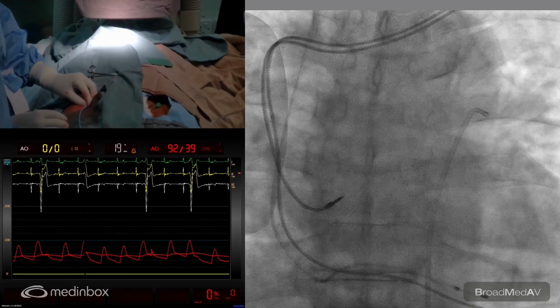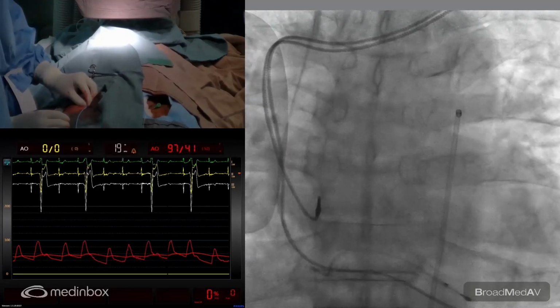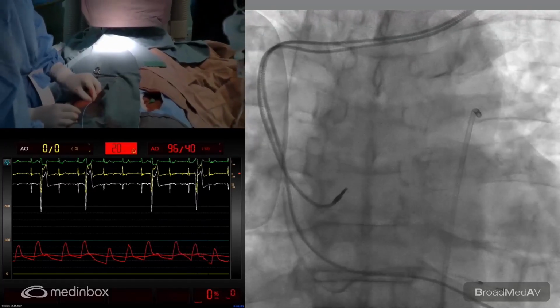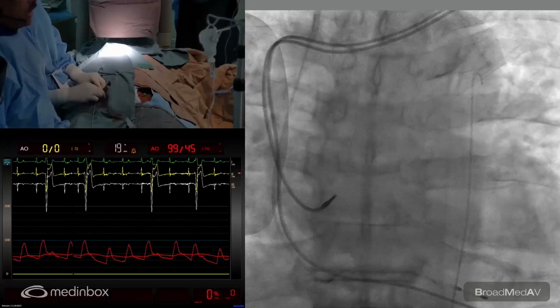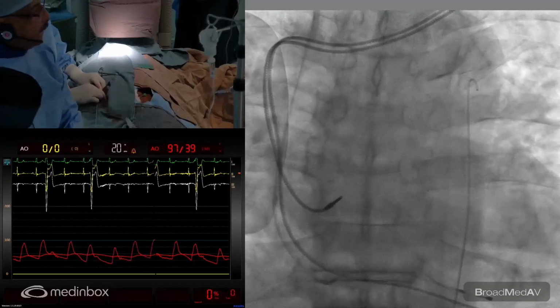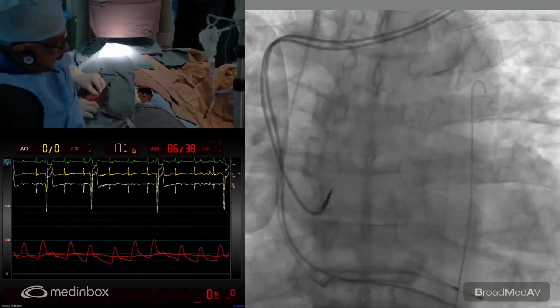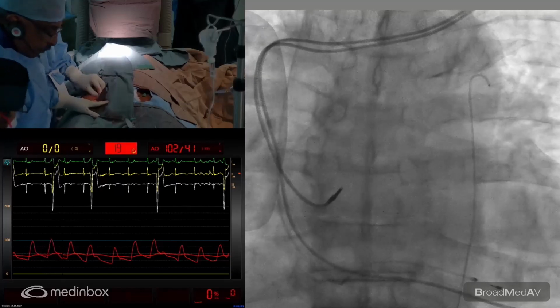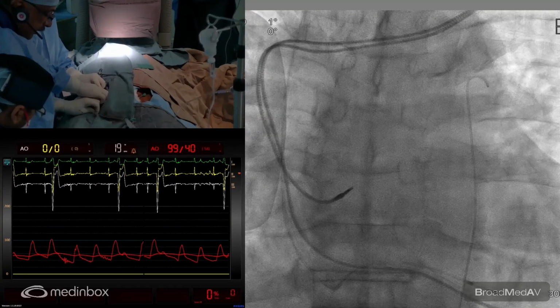So as we discuss this case, you see this patient has already got a dual chamber pacing, but we cannot depend on that. And you can see a temporary pacemaker in because we need to control the pacing, which we can't do with permanent pacemakers. So it's very important that you have the temporary pacemaker put despite the dual chamber pacing being there. So we now remove this and we get the sequential dilator, please.